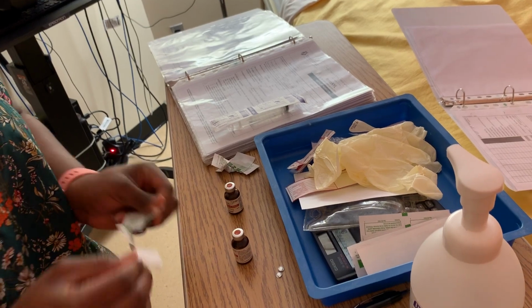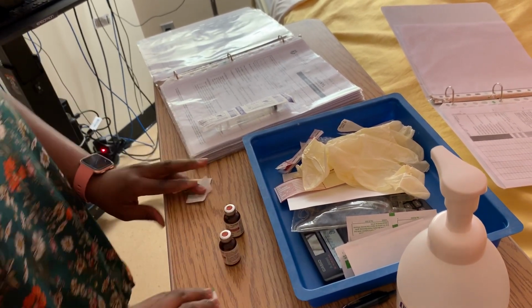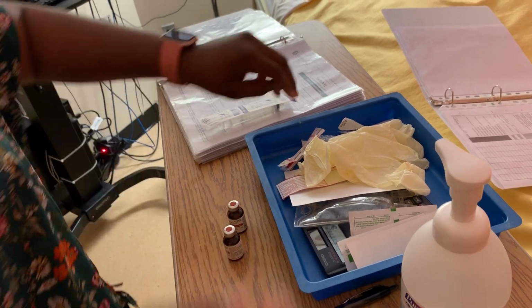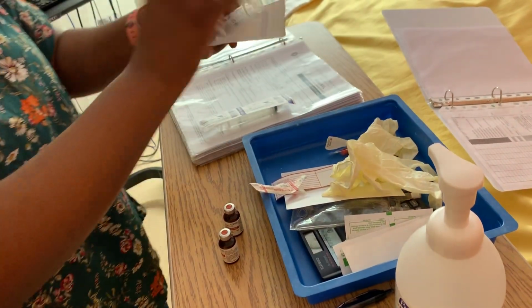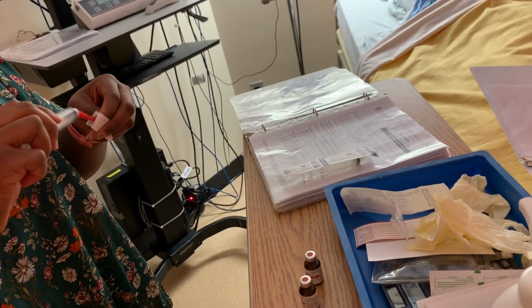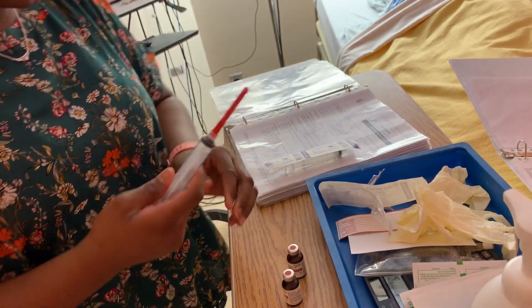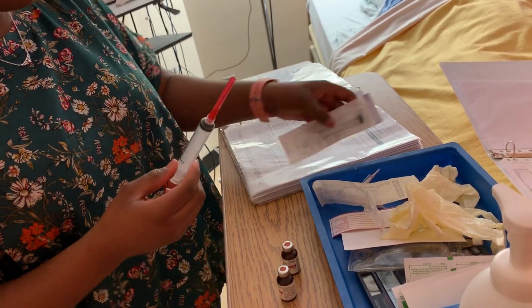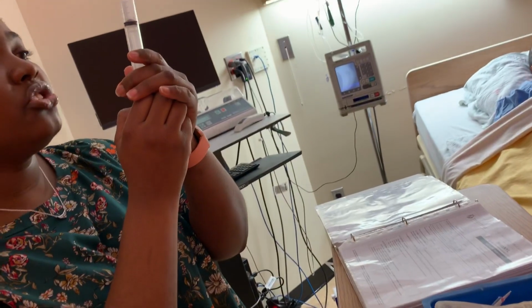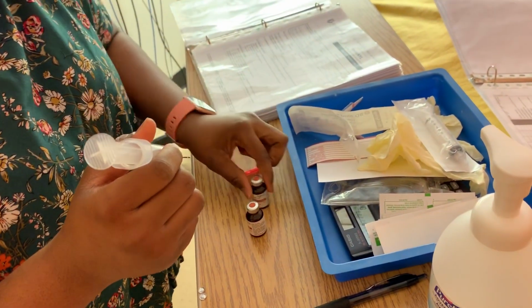I'm also going to alcohol swab this one for 30, and I'm going to let them dry for 15. So as I'm letting it dry, I'm going to connect my syringe. So this is 5 ml, so I'm going to draw 5 ml. So to inject air, I'm going to draw 5. So I'm going to draw from the first one.